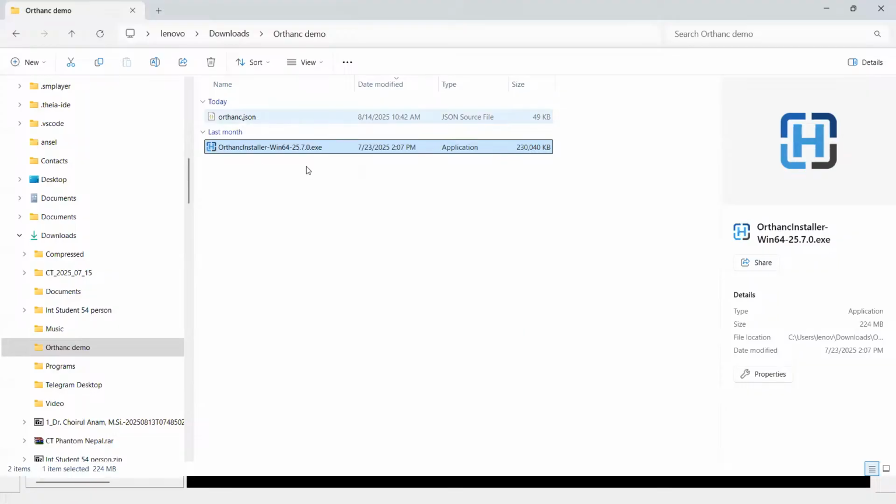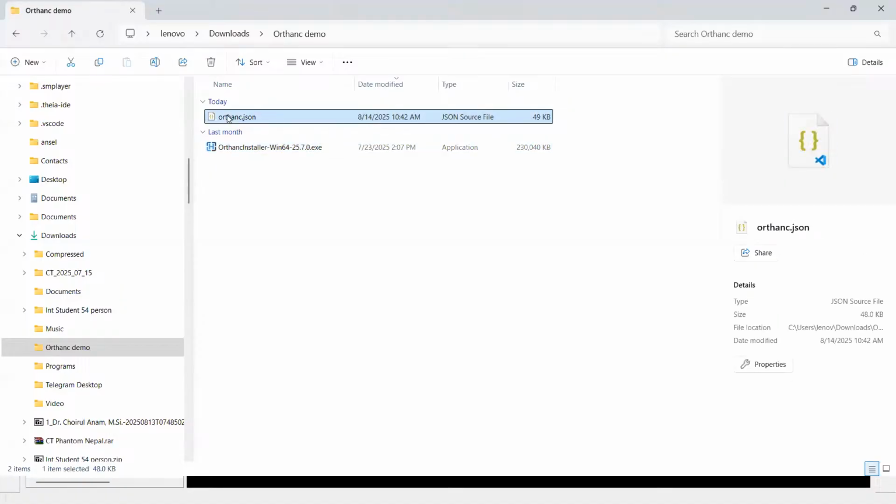And next, we will use this configuration file to replace the original one, so we can register the IndoQCT configuration into the Orthanc registration. Copy.